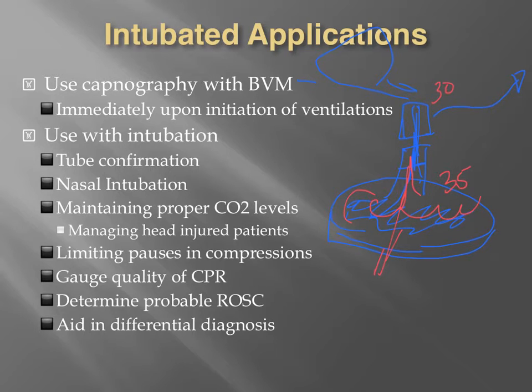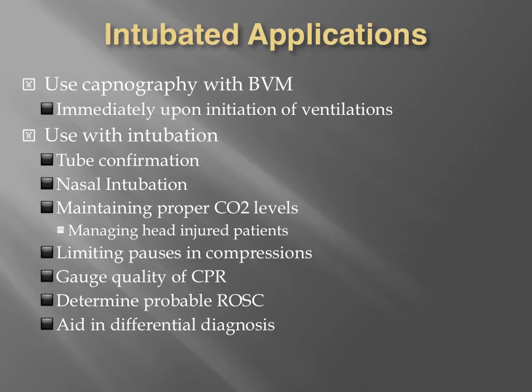And then use it with intubation, for tube confirmation. We can even use it for nasal intubation. Put that capnography device on the end of the tube, and while you're listening and feeling for the tube to get into place, you can also monitor the waveform, or the lack thereof, for tube placement while you're looking at the monitor.